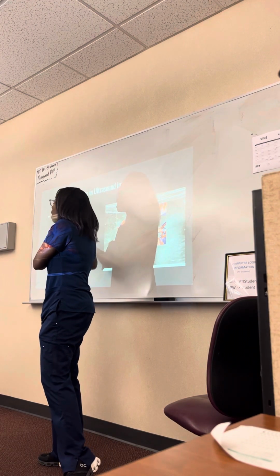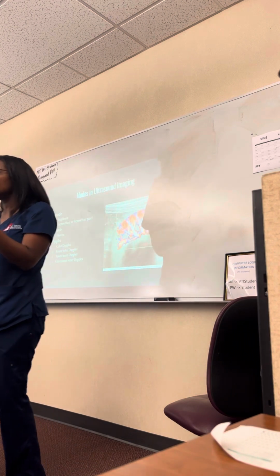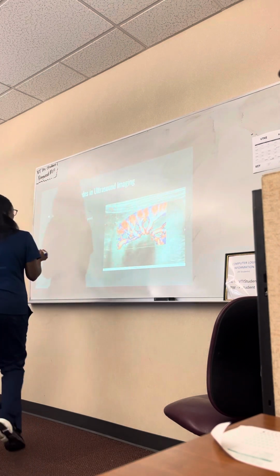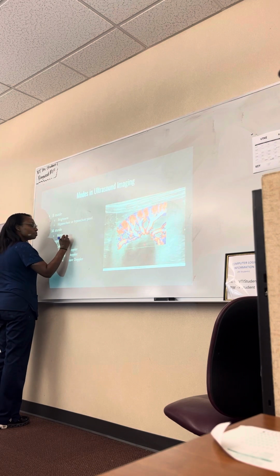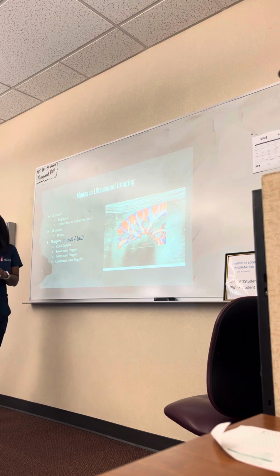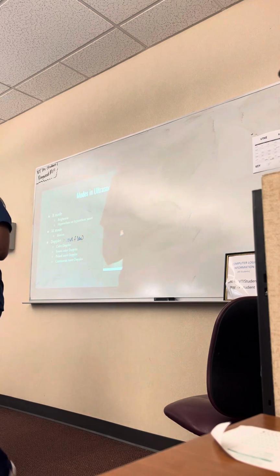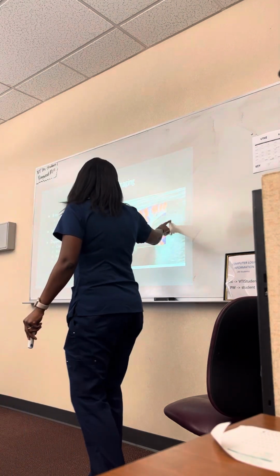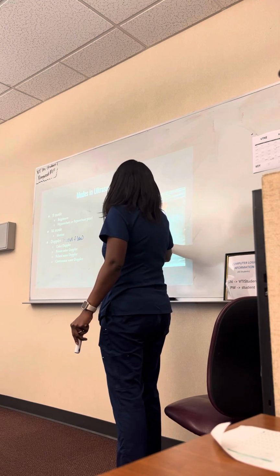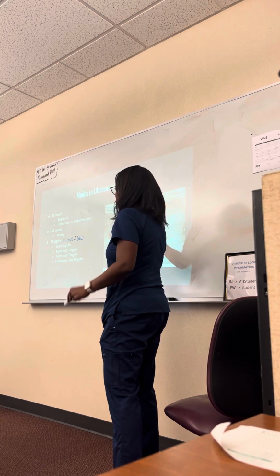Doppler, there's different Dopplers. So Doppler is basically showing how blood is flowing through these different vessels and at what velocity they're flowing through. So Doppler is for blood flow. Now, if I'm using a color Doppler, this is what we have here. So the color Doppler is here. This is an image of the kidney, and it's showing you how the blood is flowing through the kidney.